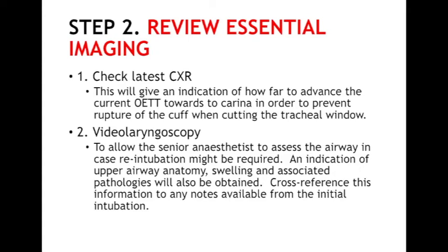In some patients, a degree of laryngotracheitis has been described, although it is not clear whether this is viral related or pressure related from large-sized tubes being placed. It is prudent to cross-reference with any notes from the original intubation of the patient to ensure that the senior anaesthetist has a sufficient understanding of the upper airway should emergent reintubation be required.